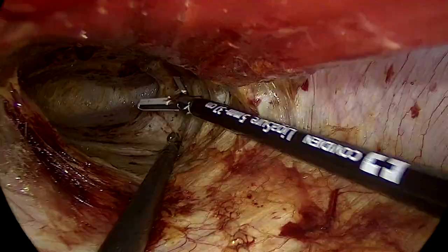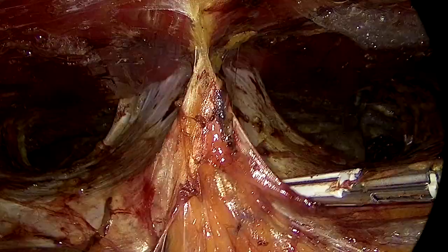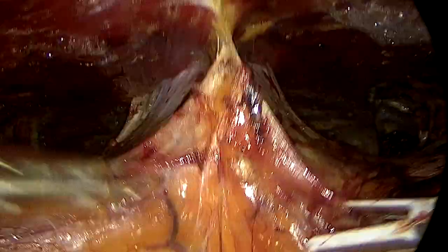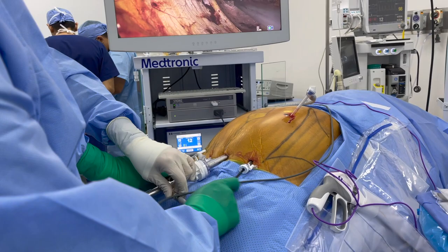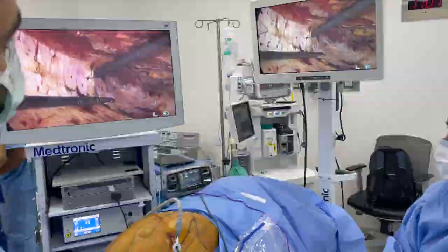Just finishing up some of the dissection close to the midline, you can have a very nice view of the volcano sign — the two leaves of the posterior rectus sheath coming together and the outline of the hernia defect. This is when an important first trick comes into play. Dissecting from the pelvis can be very challenging, so what I do is turn my right hand to the port in which I initially entered the abdomen — this provides a much better angle to do my crossover on top of the round ligament.